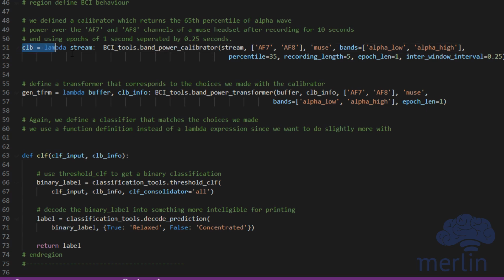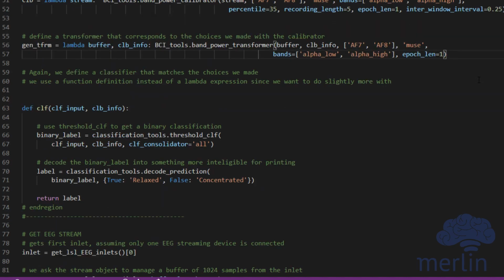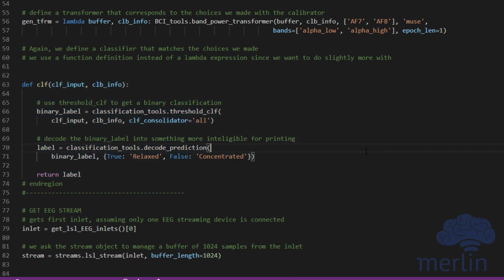Calibrate. Use the band power calibrator function to get a baseline value for average alpha wave magnitude for that user. Transformer. Use the band power transformer function on the incoming stream to transform into the frequency domain and provide magnitude outputs for the alpha low and alpha high bands. Classifier. Use the value from the calibrator in a thresholding function to compare to the incoming data from the transformer. If the incoming stream data has a lower alpha wave magnitude than the alpha wave average sampled in the calibrate step, then you consider it more concentrated.